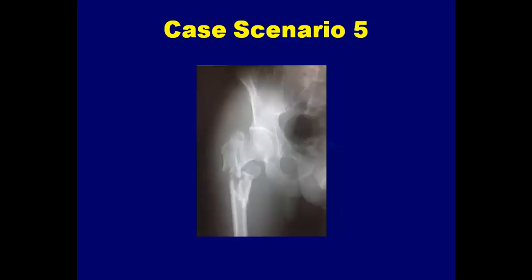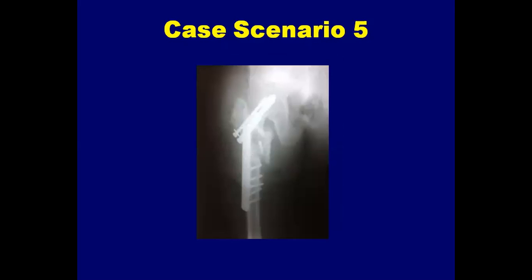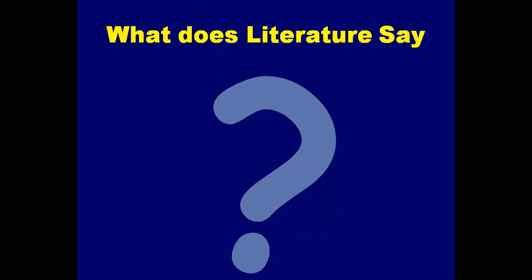So here is another patient with a subtrochanteric fracture. You can see the valgus fixation with a nice bypass of the comminuted fracture in the subtrochanteric area. And they all united well with a few millimeters of collapse of the trochanteric fractures. So what I mean to say is that PFN is not the panacea. These fractures can all be very well managed with the dynamic hip screw as well.